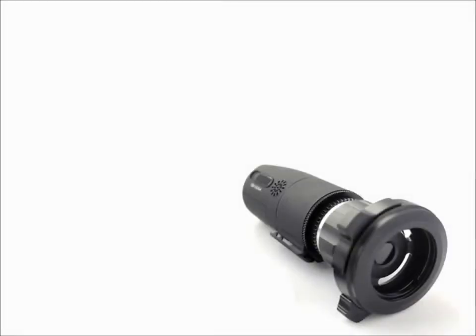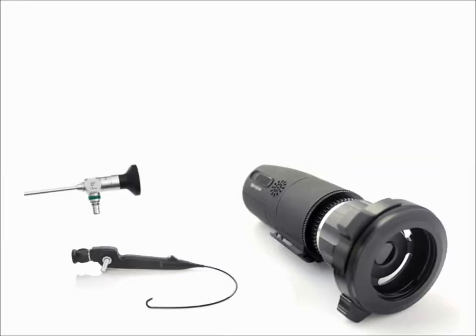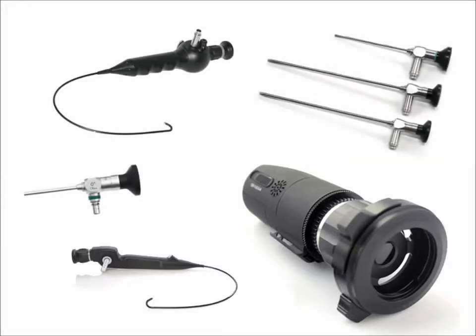The Firefly is an incredibly versatile endoscope camera that can adapt to various types of rigid and flexible scopes, such as pharyngoscopes, sinoscopes, autoscopes, and the like.